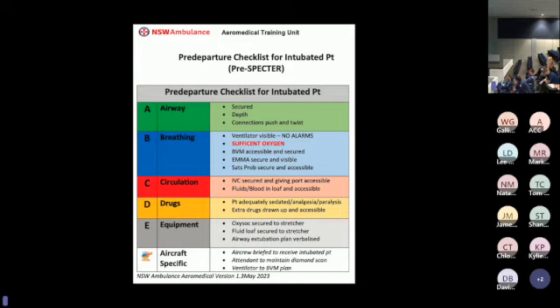So 14 were given the Medumat, and 7 were given just a handbag, standard practice, standard care. Now, out of those, 2 didn't detect a disconnect, right? So that's the handbagging group.